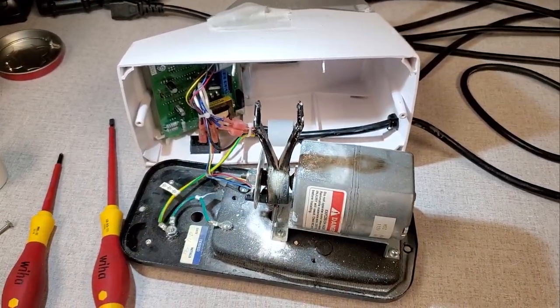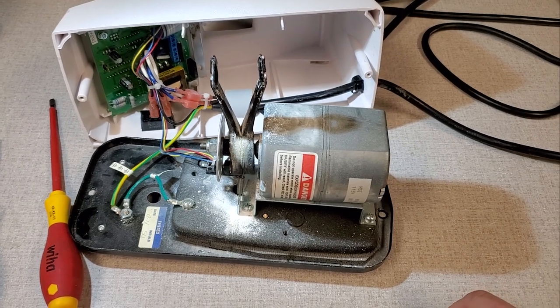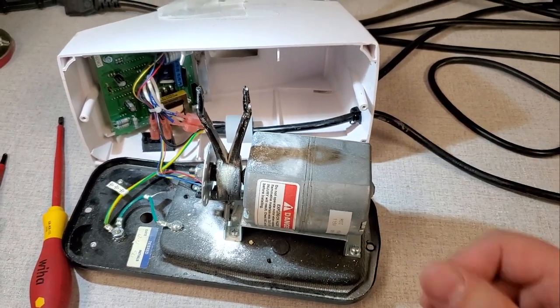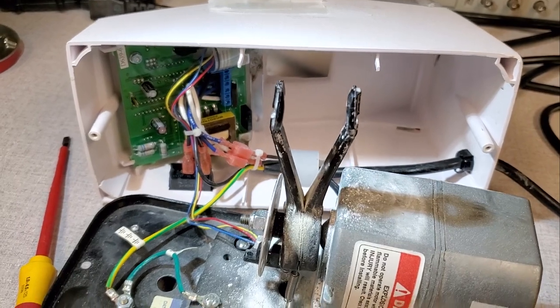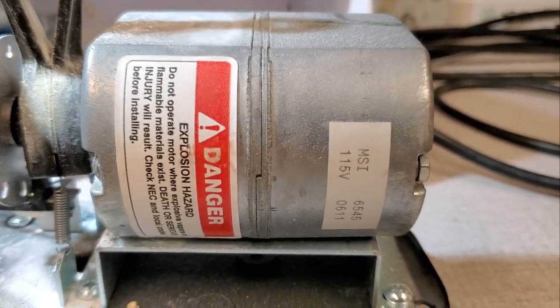Now the last motor that I'm going to cover in this video is this guy right here that's found in a mixer unit. Mixers are found in dental offices or laboratories. And what it does is it takes a test tube and it shakes it really, really violently. You can see the mixer head right there. It grabs onto whatever and shakes it.